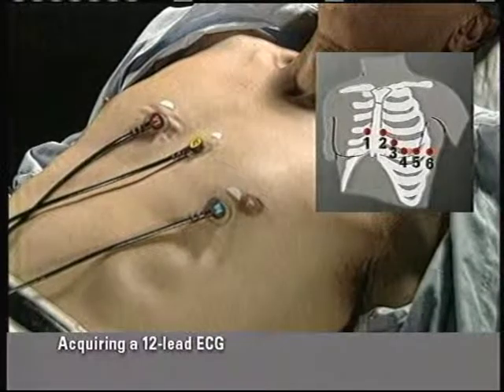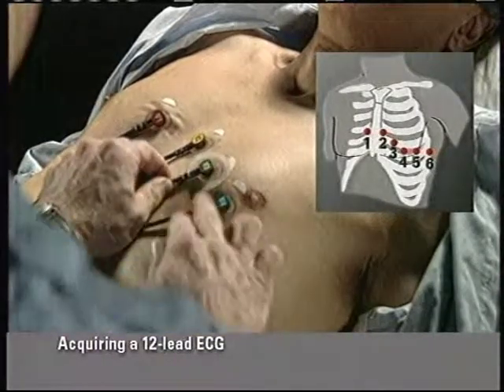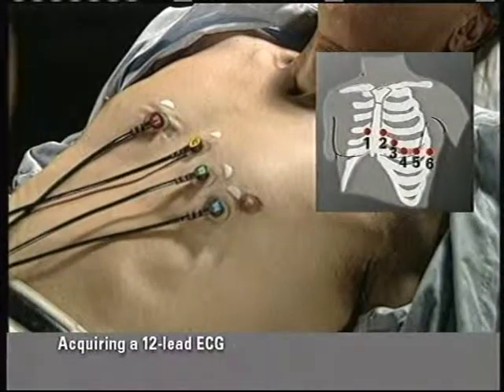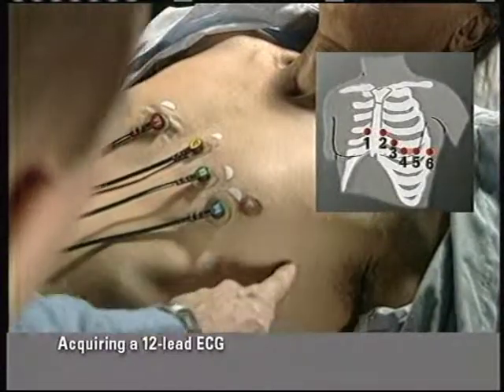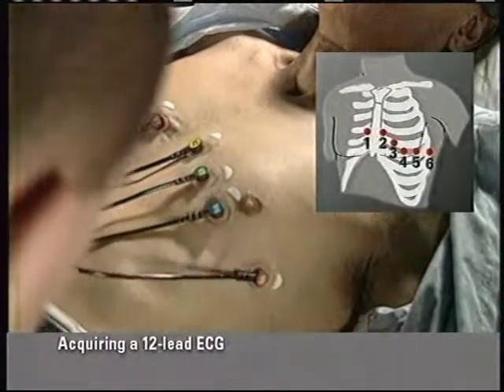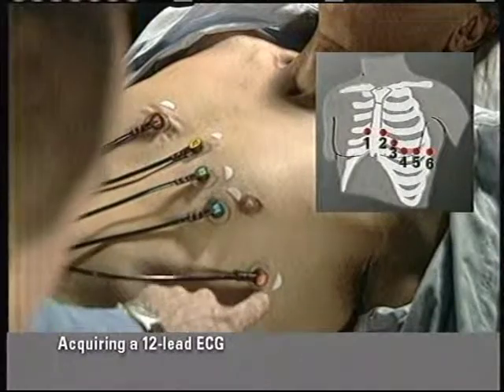Place the V3 electrode directly between V2 and V4. Place the V5 electrode level with V4 at the anterior axillary line. Place the V6 electrode level with V5 at the mid-axillary line.